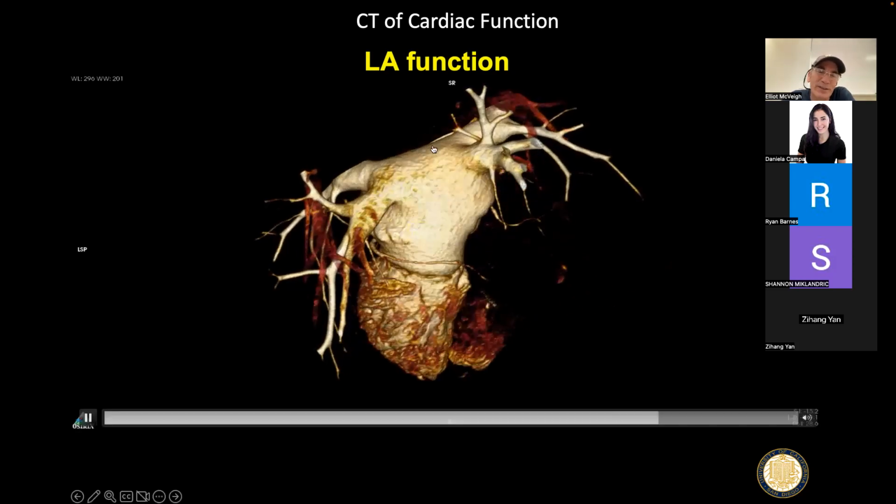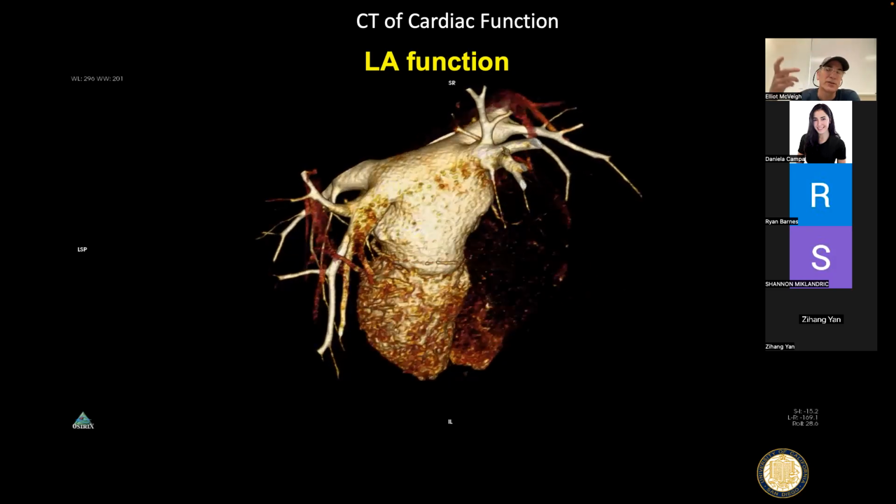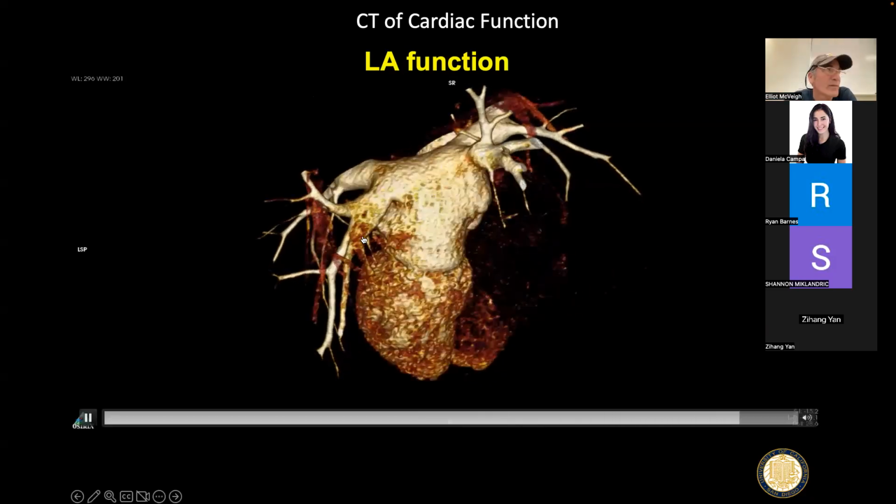So you could make up a whole research field of your own, just saying, how could I model these pulses of different concentration to measure flow? Think of it in the positive direction. If you just put a little puff of concentration, not filling the whole blood pool, just put a puff and then watch that thing go around the heart, right? It would be kind of cool. What if you could do multiple pulses of contrast?